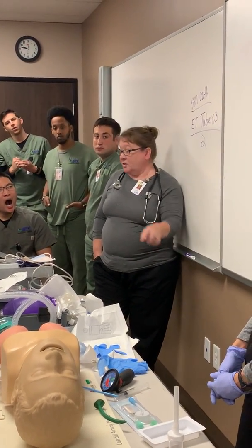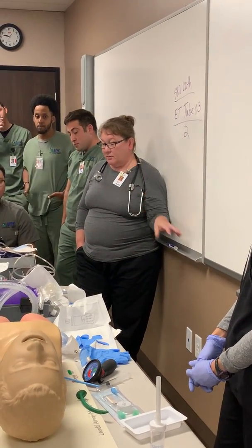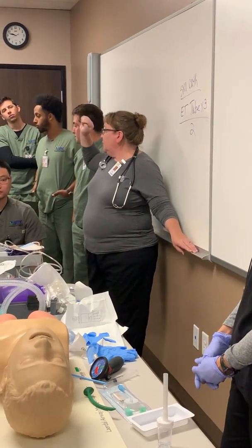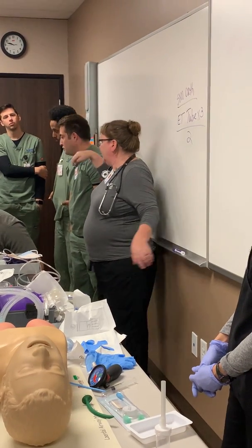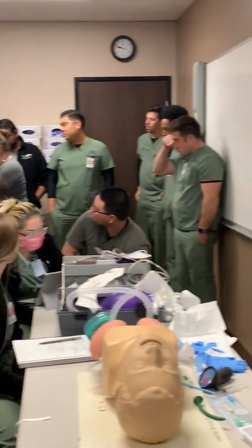You're going to get checked off on sterile suctioning too at some point, so make sure you practice that. We're bringing the suction machines in so you can see how the canisters are and make sure that you can hook them up. This is of course the old EasyVac version, but the canisters are still the same.